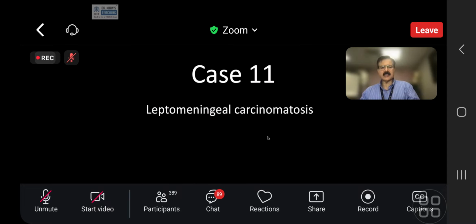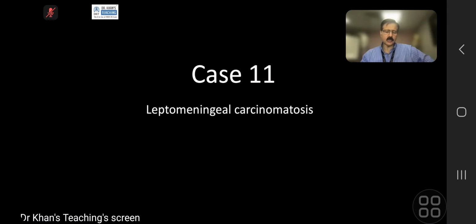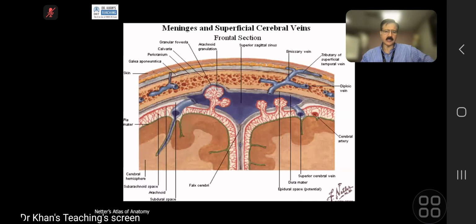So the point is this is the same or similar case which I had showed you earlier with a subarachnoid hemorrhage.